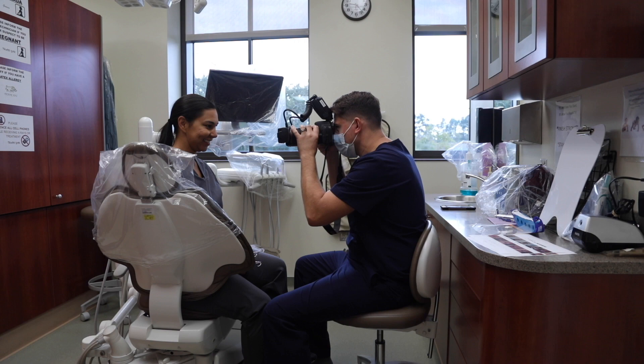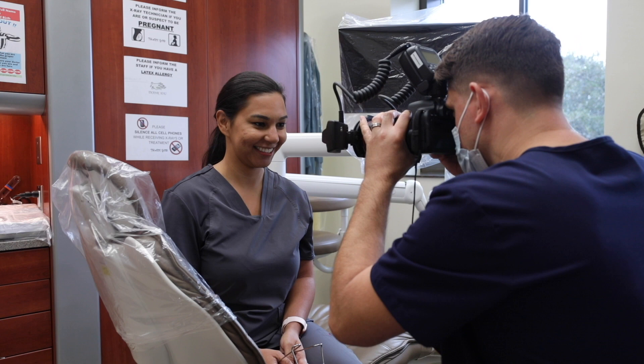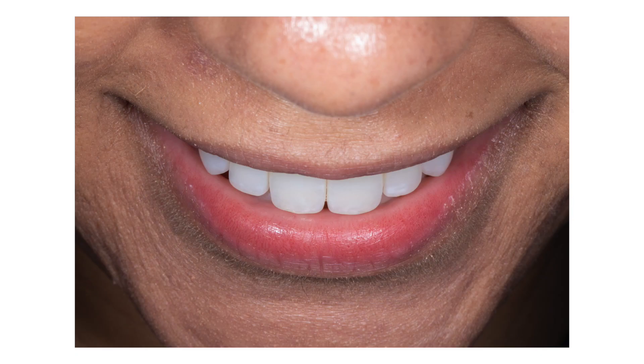Continuing with our smiling photos, we will have the patient look straight towards you and point their head down or place their chin down. This shot aims to capture how the maxillary incisal edges are positioned in relation to the wet-dry line of the lower lip when the patient is smiling.